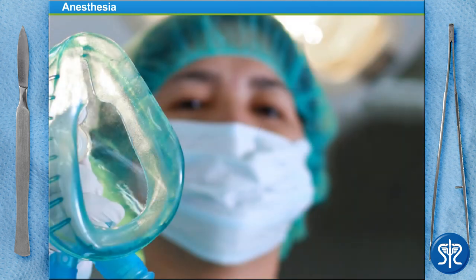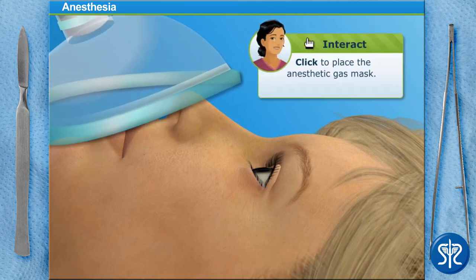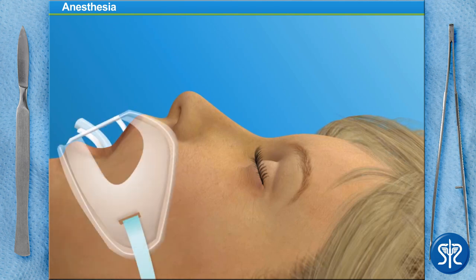While some anesthesiologists may prefer to give a patient a general anesthetic using the IV line, we'll be administering it using a face mask. Once the patient begins breathing in the anesthetic gas, her bloodstream will absorb the gas and carry it to her brain. At this point, her brain will stop receiving signals from the nerves in her body, allowing her to be completely asleep and pain-free during the surgery. Start by placing the mask over the patient's nose and mouth. Once it's in place, we'll turn on the anesthetic gas. Now that our patient is unconscious, we'll insert an endotracheal tube into her mouth and down into the windpipe. This will help her breathe and provide a constant mixture of oxygen and anesthetic gases during surgery.